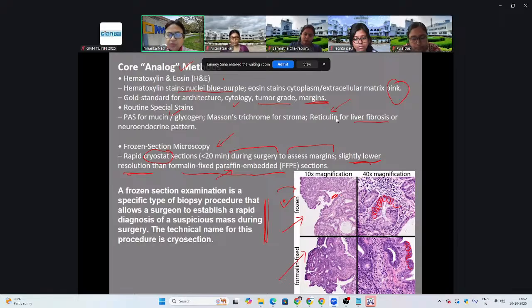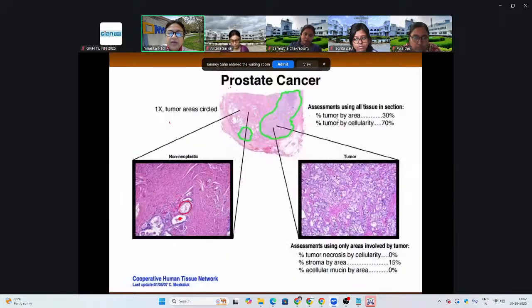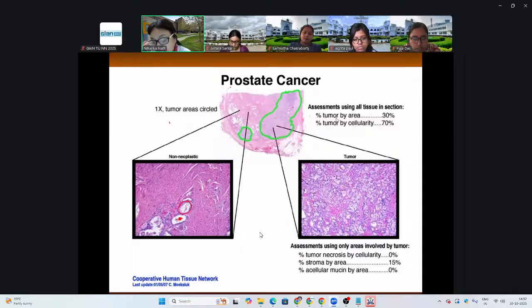So I'm hoping to give you some explanation. I'm also not a cytopathologist, but we all learn by experience. We do scanning only in mice, the xenograft that I talked about. So we look at it in those xenograft mice, which I will show you a couple of tomorrow. And so these are other tissues. Like I said, they have to be measured and counted in a tissue section, at least at 6 different points.